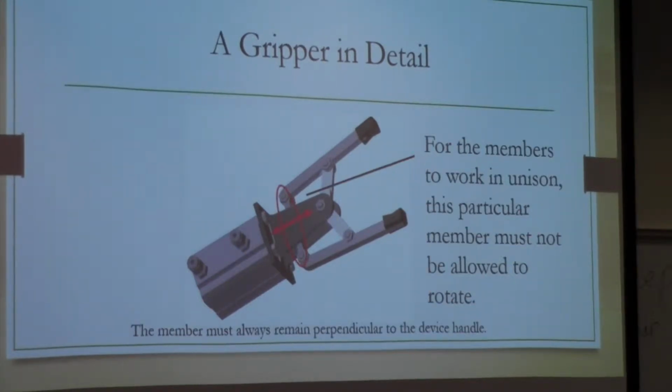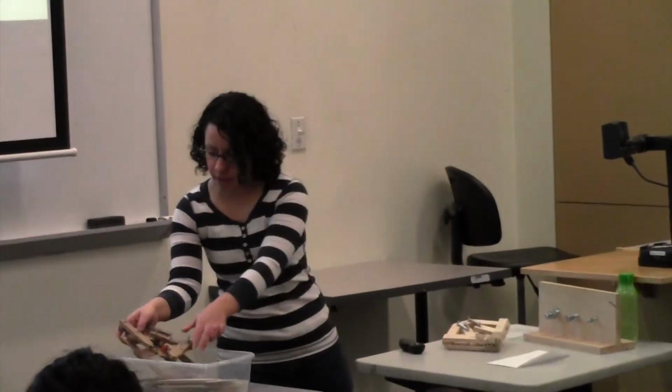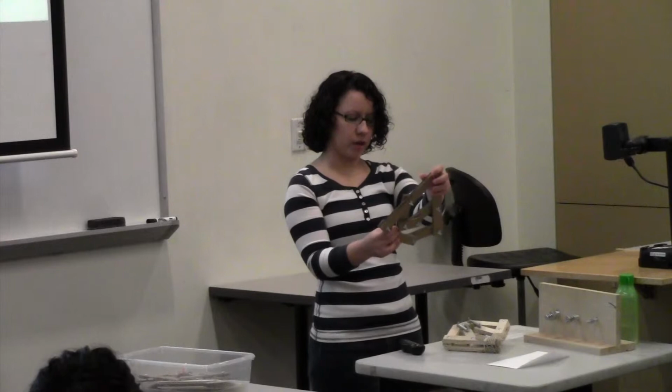And then this bottom part here. When I built it the first time, I was still trying to figure out how it was going to work. And I built this one out of cardboard first. And I realized that for this to work efficiently, this bottom piece had to be one piece. This cannot move, this bottom part, because otherwise it doesn't work as one.